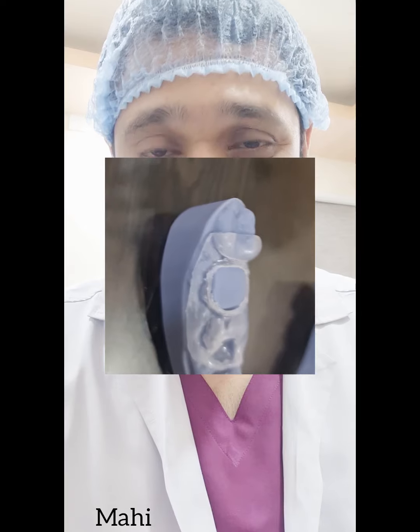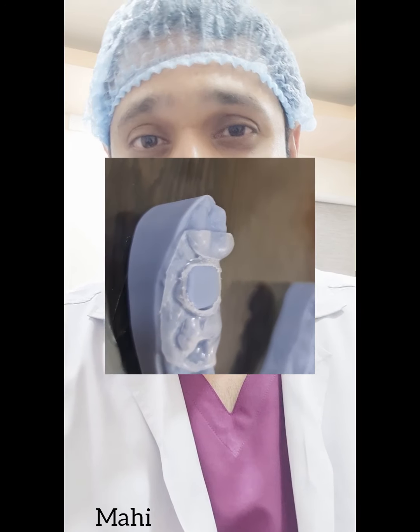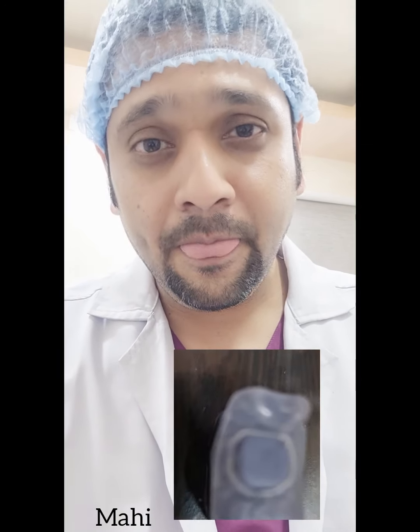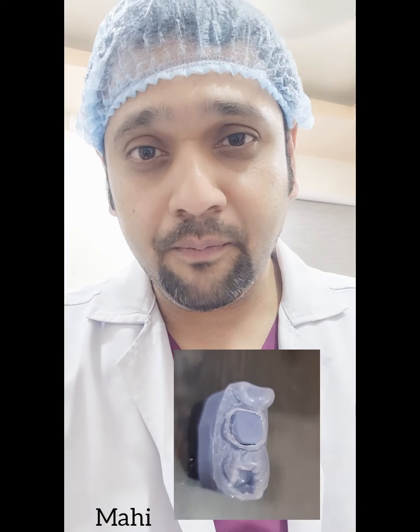Now the modifications would be done digitally, and once the modification is done digitally, the cast is again printed out. Now we make a splint to that level where the modifications are done on the cast, with an open window, and we use it on the pre-op, I mean the scan which I sent prior to it without modifications. Now, whatever is projecting out from that open window of the splint, we can keep it intraorally and reduce the projected portion on the occlusal surface.